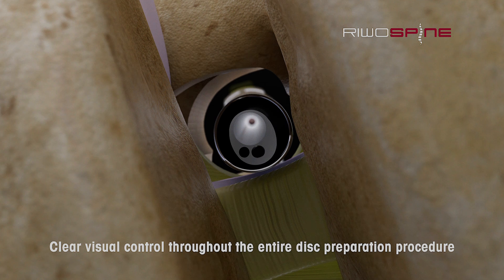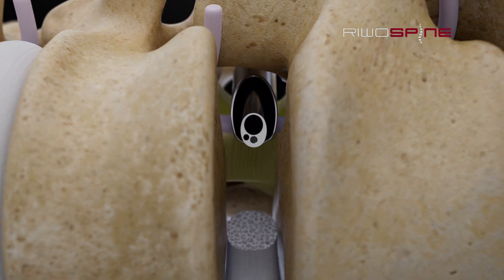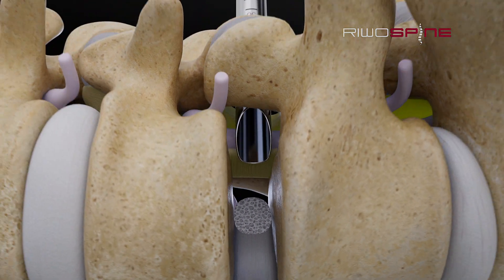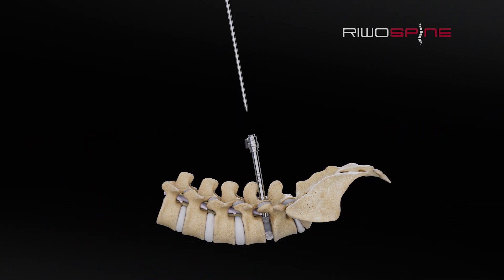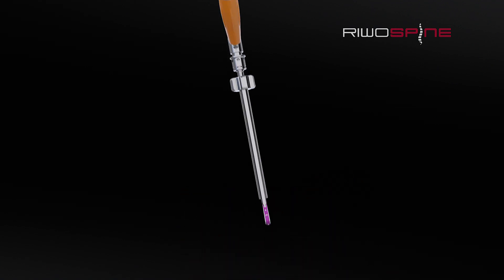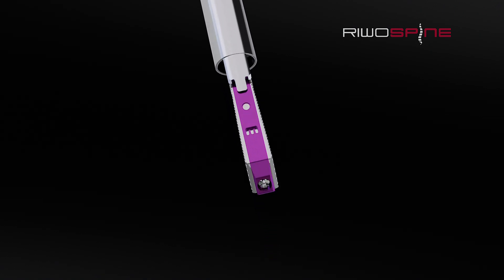To insert the implant into the disc space, surgeons have the option of expanding the access space with a slightly larger working sleeve that protects all neural structures and allows for the insertion of the expandable fusion cage. Highly important, the height restoration and mobilization of the disc space must be performed before the cage insertion. The cage will support the prepared disc height after expansion, but it is not performing the distraction itself.